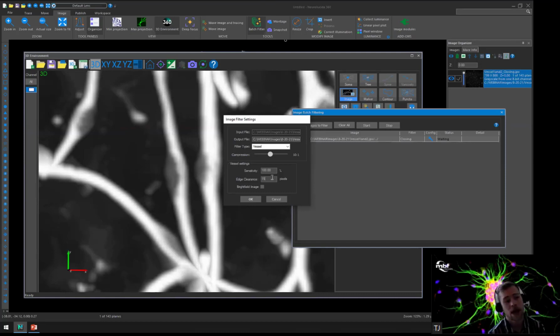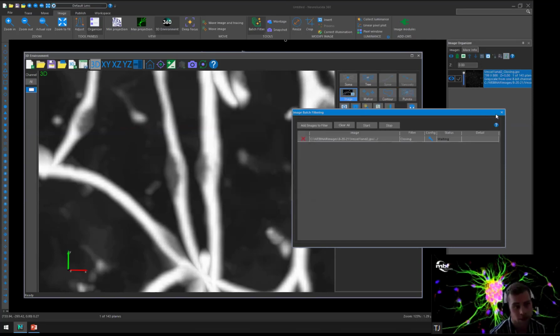The way we do that is we want to find the edges of the vessels. Any edge structure is going to be found, and those are going to be hard-lined edges. And from there, the algorithm is going to try to close and fill in everything between those edges as best as it can, while simultaneously looking for the background. It's going to create that stark contrast between what is filtered in the foreground, and it's going to fill that in as nicely as it can. And then the background will be kind of disparaged from there.